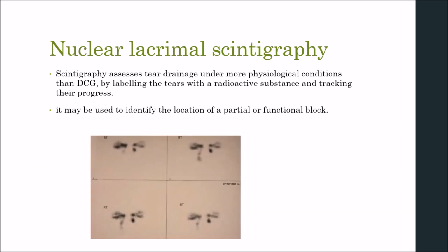The next test is nuclear lacrimal scintigraphy. Scintigraphy assesses tear drainage under more physiological conditions than DCG by labeling the tears with a radioactive substance and tracking their progress.